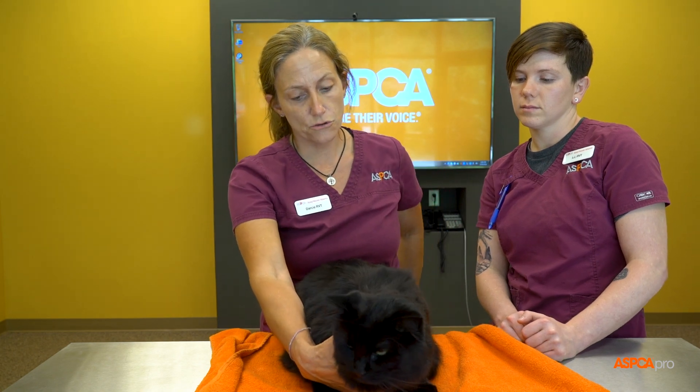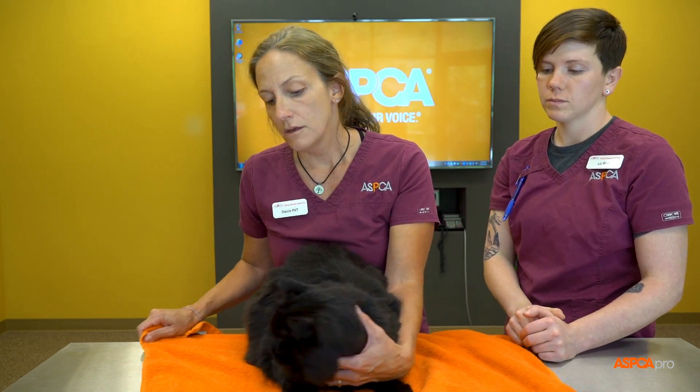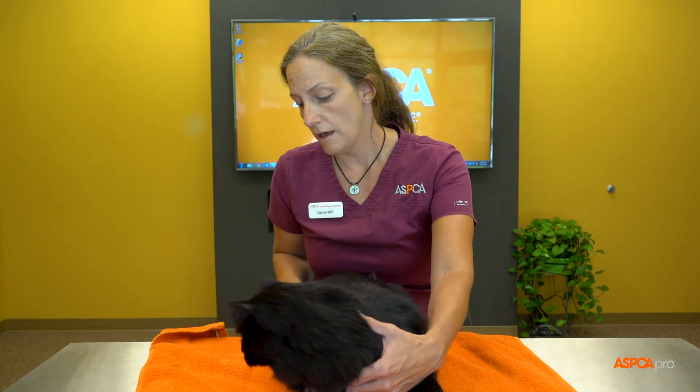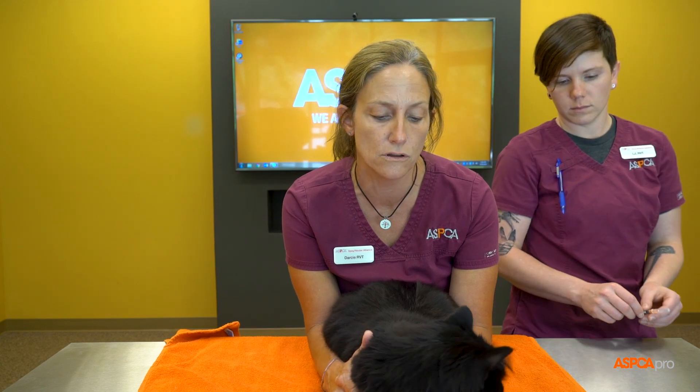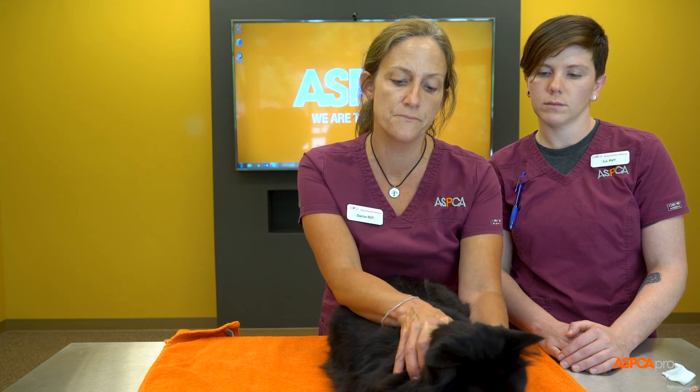The last thing we wanted to show you was how we like to position a cat for a medial saphenous blood draw. Having a cat on a towel is always a comfort — have a towel ready. We have them in sternal recumbency; she's already lying down. If they aren't lying down, just put a little pressure on their shoulder blades and they'll usually lay down.